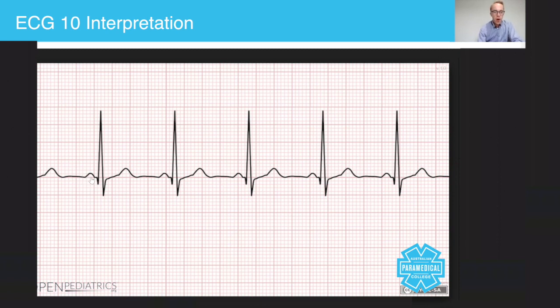Then you need to look at the QRS complex. Is there a QRS after every P wave? Yes. So this is the QRS complex here — this is the Q, this is the R, this is the S. Is it nice and straight — straight up, straight down? Yes it is. Is the QRS interval less than two and a half small squares? Yes it is. Good.